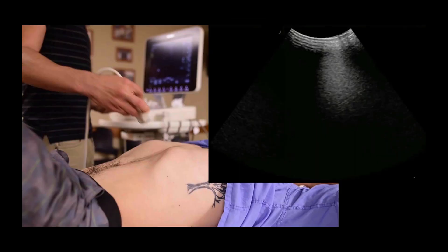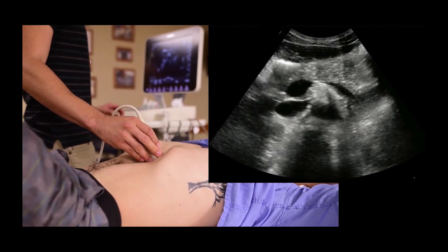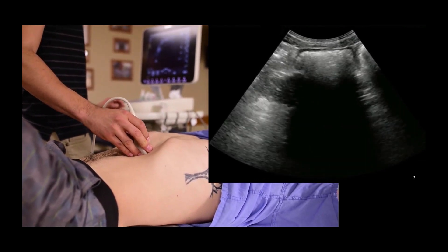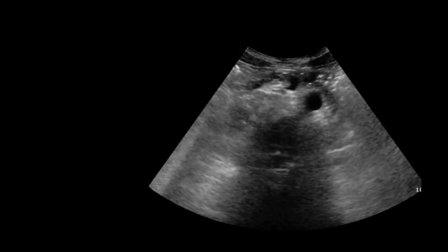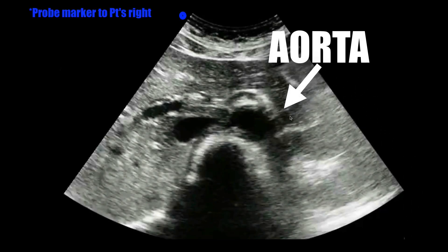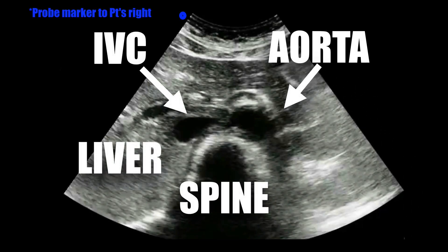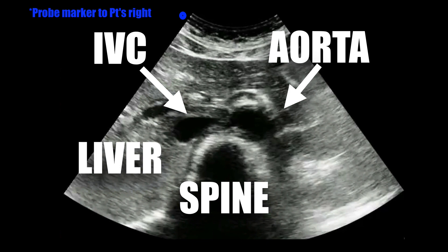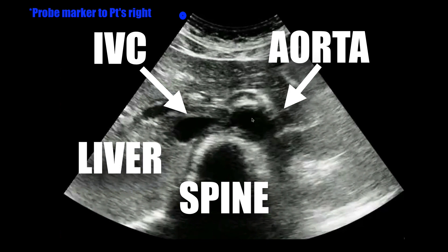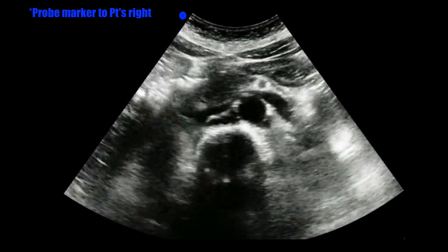So here is how you do the examination. Place that probe in the epigastric area and you should get an image that looks a little bit like this. We have our aorta over here, our IVC over here on the left, liver on the left, and the spine. You want to evaluate this little guy right here — this is the aorta. You want to see how big it is.